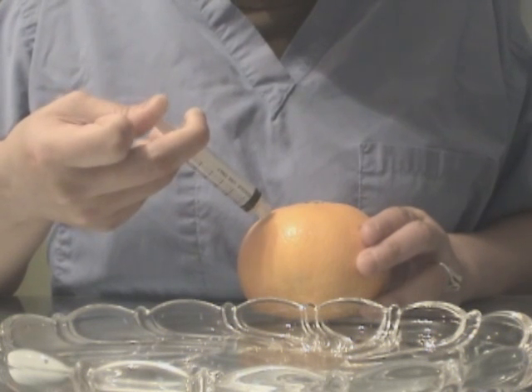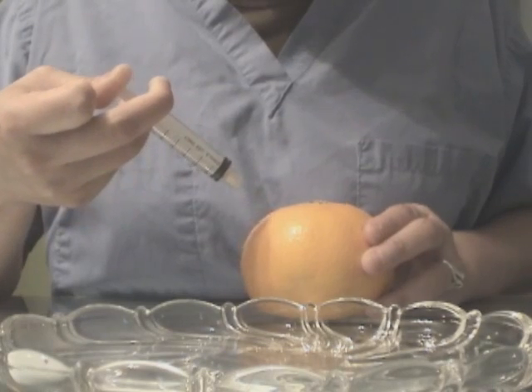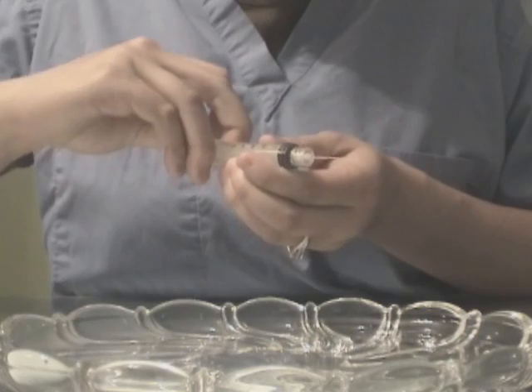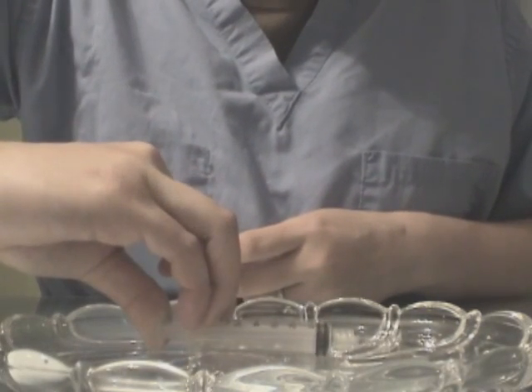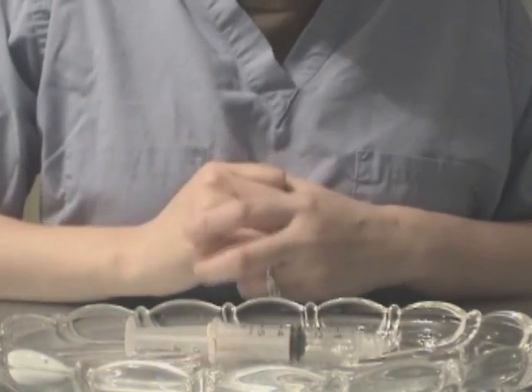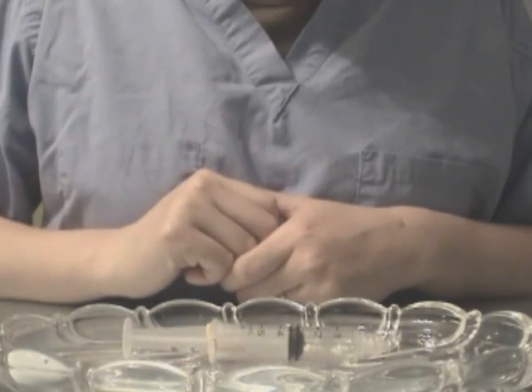I am going to give it a real good push, just like last time. Then this time, instead of holding on to the syringe, I am going to pretend that I am going to put it right into the safety bin and I am just going to let it go. As you can see, the needle is back into its compartment. Thank you.